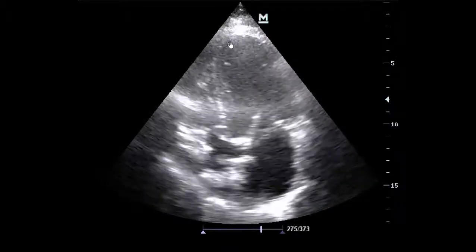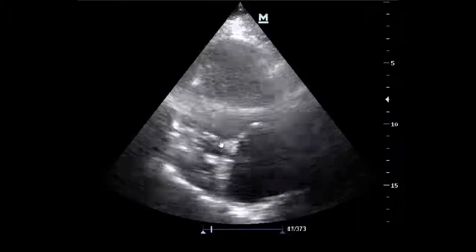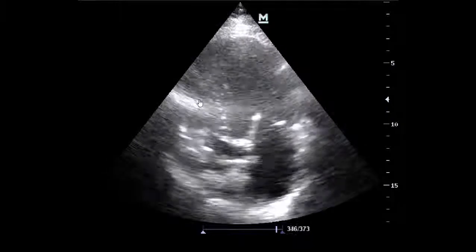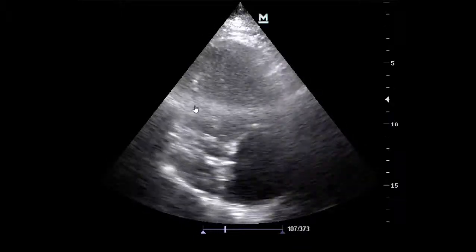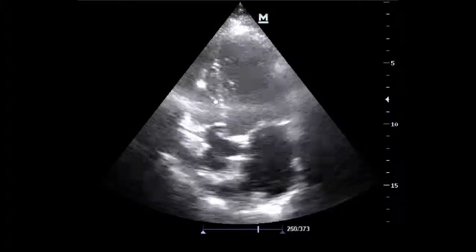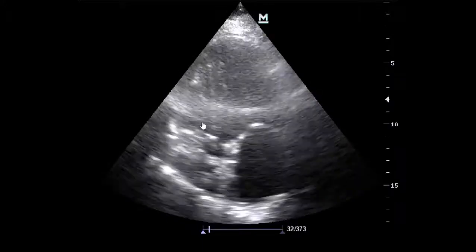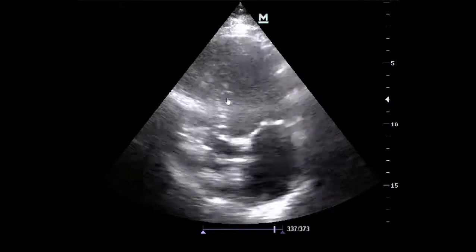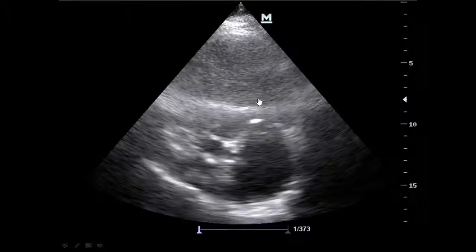So despite the patient having ischemic cardiomyopathy and a bad ejection fraction, there is a narrow inferior vena cava and a collapsing, narrow right side. That definitely denotes that our patient is hypovolemic with ischemic cardiomyopathy.